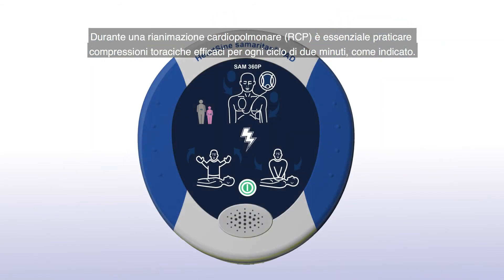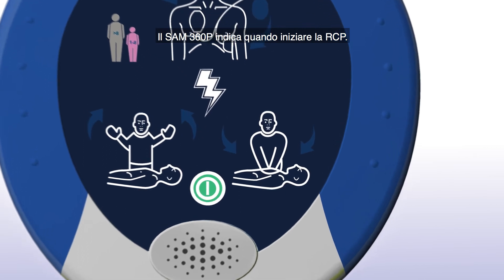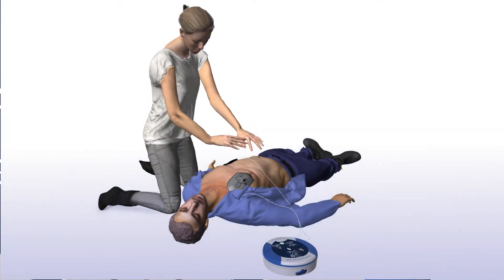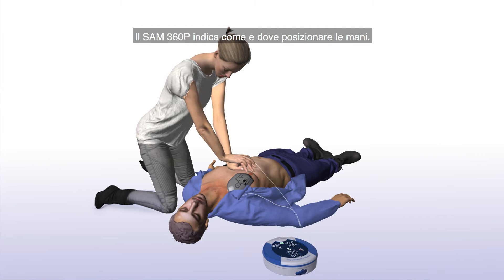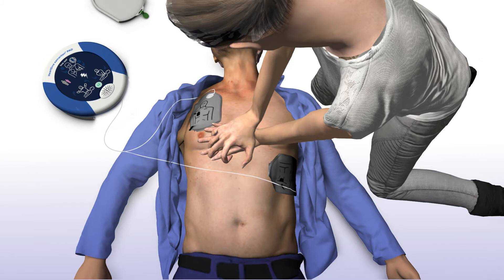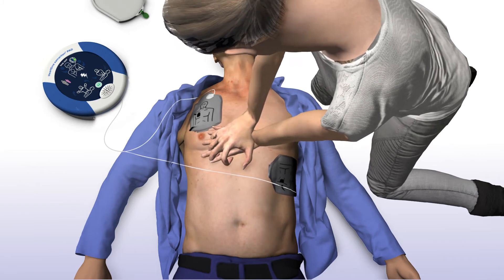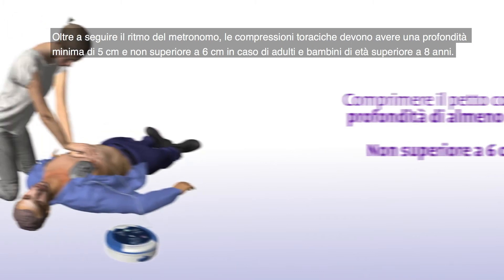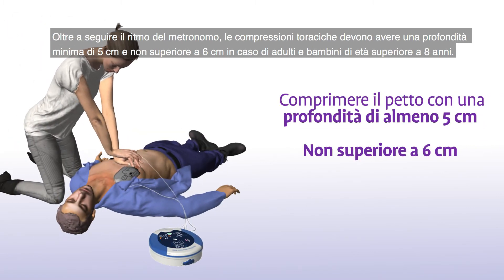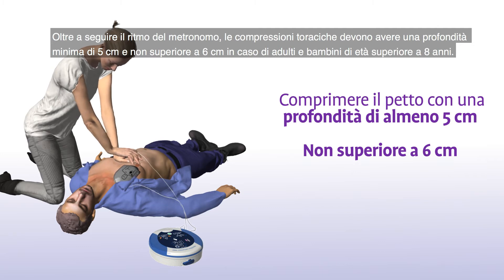The device announces: "Shock erogato." When performing CPR, it's important to apply effective chest compressions for each 2-minute cycle as directed. The SAM 360P will prompt you to begin CPR: "Iniziare la CPR. Il paziente può essere toccato con sicurezza." The SAM 360P will tell you how and where to place your hands: "Posizionare le mani sovrapposte al centro del torace. Premere sul torace seguendo il metronomo. Restare calmi." In addition to staying in time with the metronome, your chest compressions should have a depth of at least 5 cm or 2 inches and not greater than 6 cm or 2.4 inches for adults and children greater than 8 years of age.